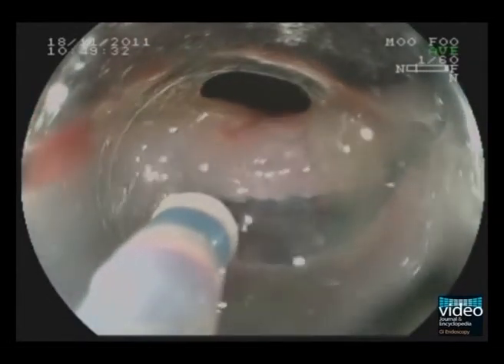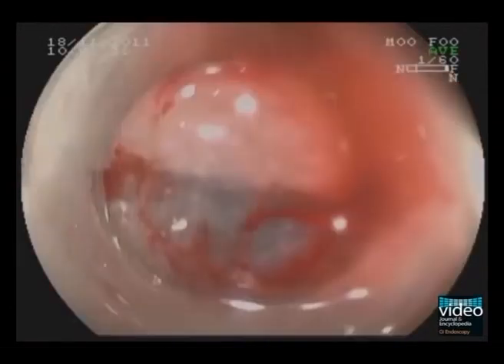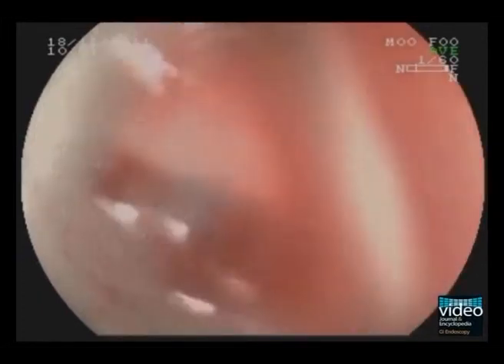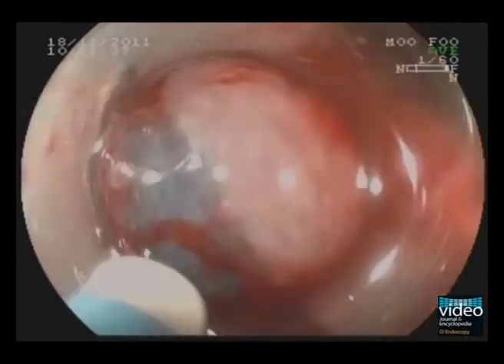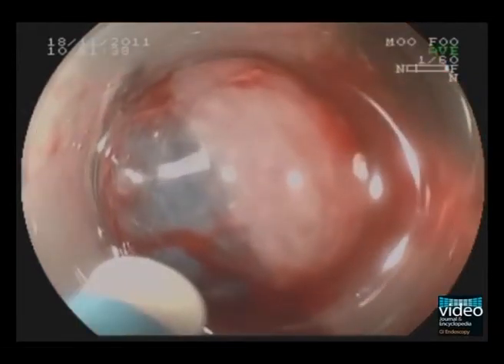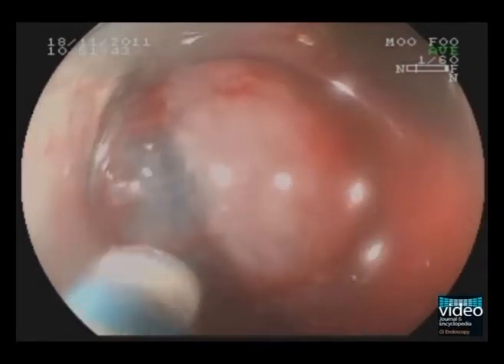When bleeding occurs, the bleeding spot can usually be localized by irrigating with water. A helpful trick is to push the cap near the bleeding spot in order to reduce the amount of bleeding. As you can see here, coagulation can be carefully applied with the same device used for the dissection, in our case the dual knife.